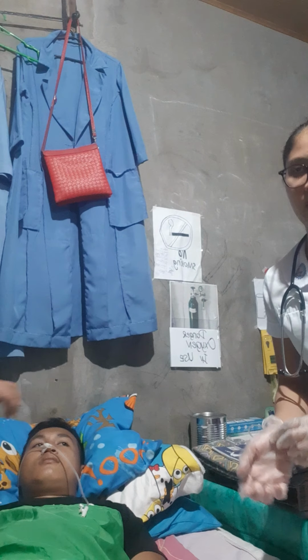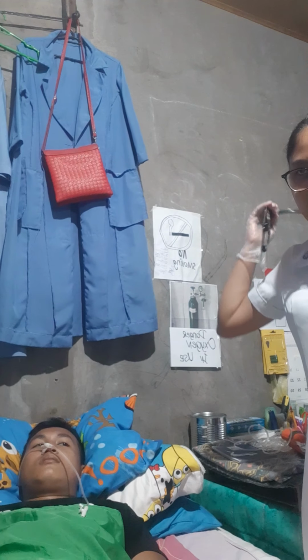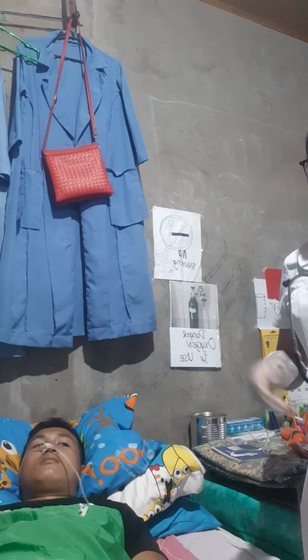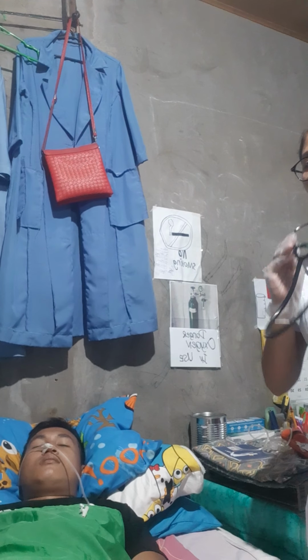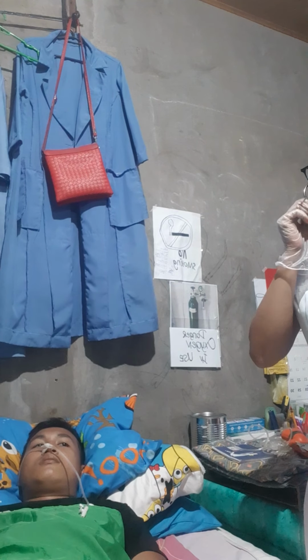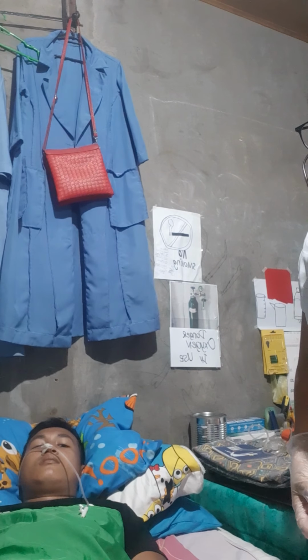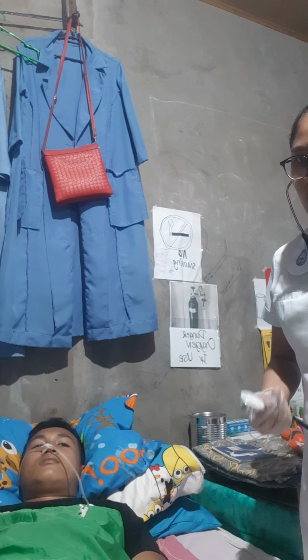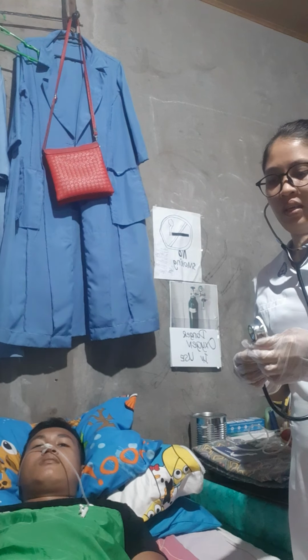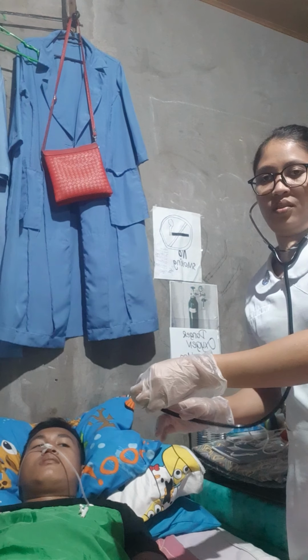Then afterwards, we can place the stethoscope over the epigastrium of the client to hear the whooshing sound, so we can listen while it is on his epigastrium.